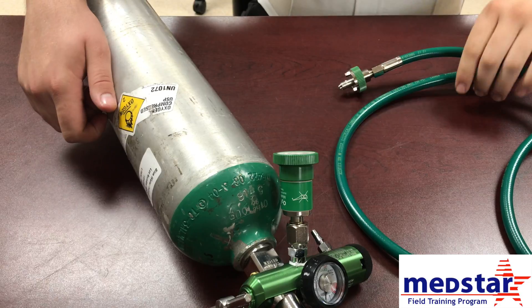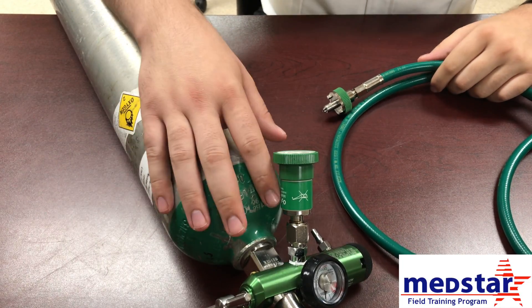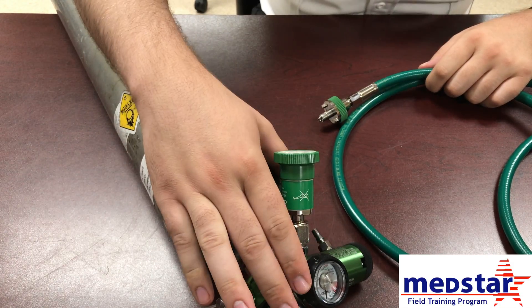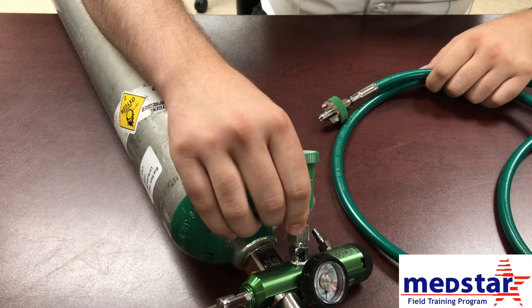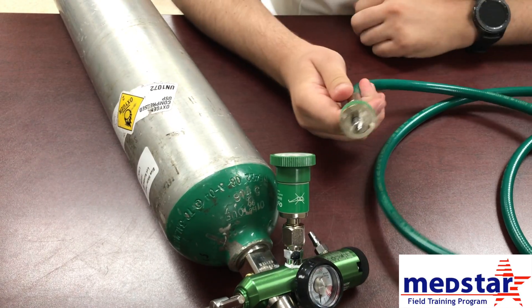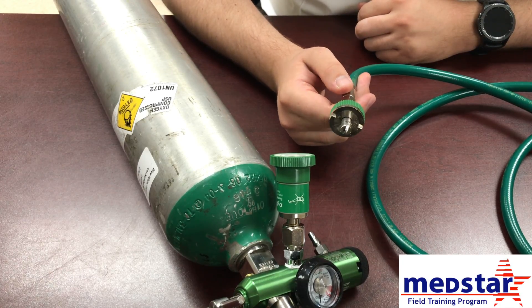Now we'll go over how to connect your oxygen hose from your ventilator to your oxygen source. Most of the time when you're picking a patient up, you're going to be connecting it to your portable oxygen source. Your O2 regulator should have the quick connect for your high pressure oxygen source, and your oxygen tubing to your ventilator should also have the connection for the high pressure.